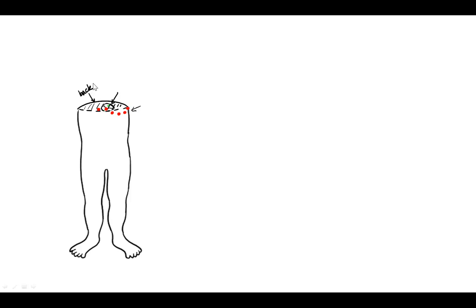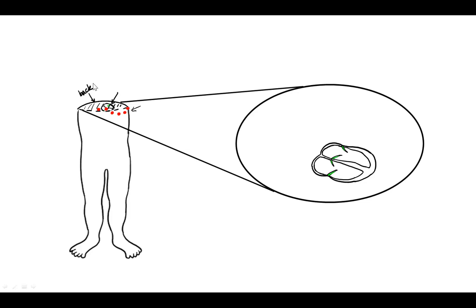So if we were to kind of blow up this image of the cross section and turn it on its face so that now here is the person's back and here's the person's front. So essentially what you've done is you've taken that cross section and flipped it so that it's now lying on the page flat. What you would see is here are all of the electrodes, the precordial or chest electrodes, and they are all positive. And then we imagine that the entire backside of the patient is negative.